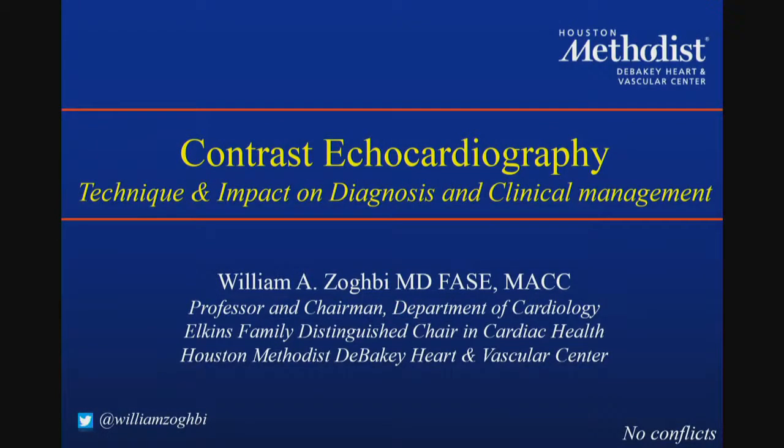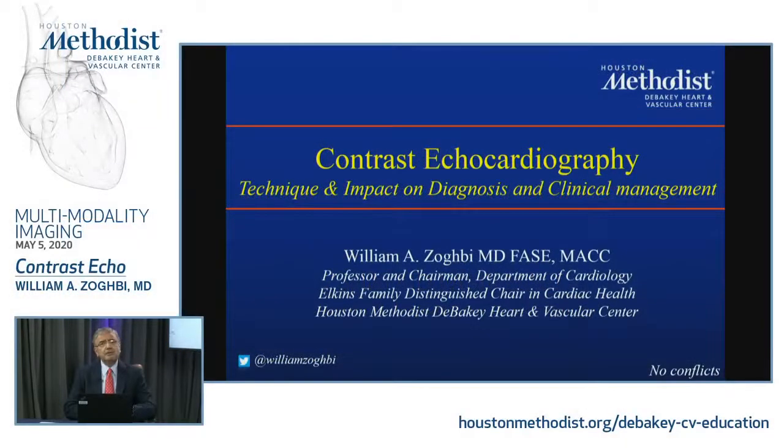Contrast echo is unique, I think, whenever we talk about contrast in any imaging modality, because in echocardiography, as many of you know, the contrast generation of the image and the enhancement of the image is not only predicated on the imaging agent that we use, but also the settings of the ultrasound machine so that it can enhance it. And at times, if the wrong settings are put together, you may actually destroy the image and may not have the most pleasant image for you to be able to make your diagnostics or any information that you may want to get from the contrast echocardiogram.